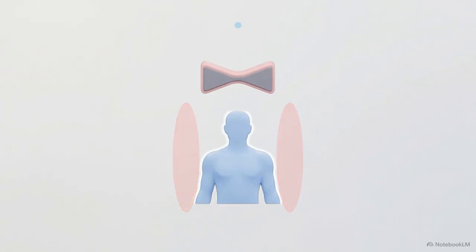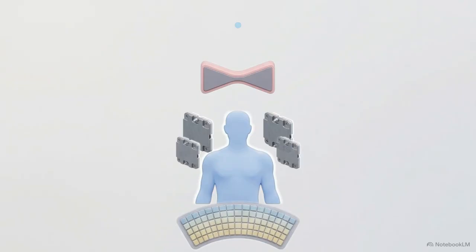From there, mechanical collimators shape the beam. The pre-patient collimator restricts the exact thickness of the exposure, while the pre-detector collimator sits opposite the patient, blocking scattered radiation from reaching the sensors and degrading the final image contrast.